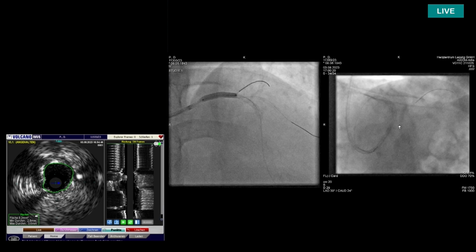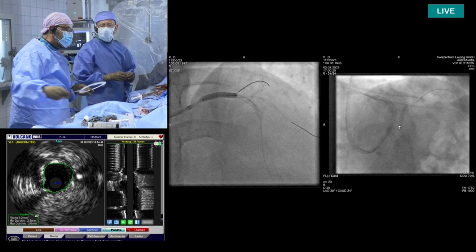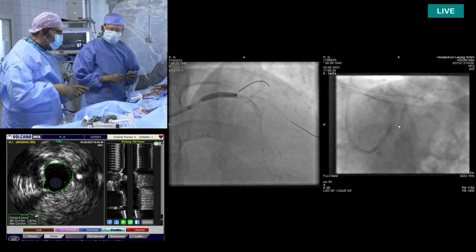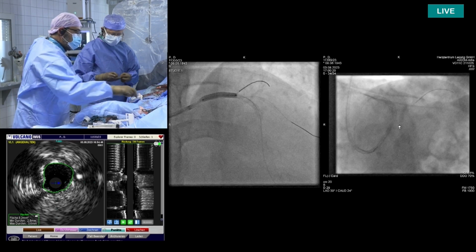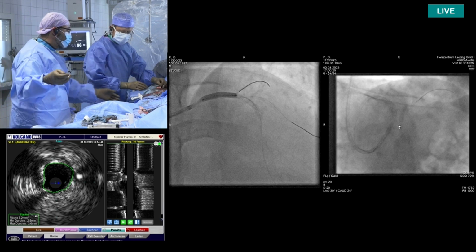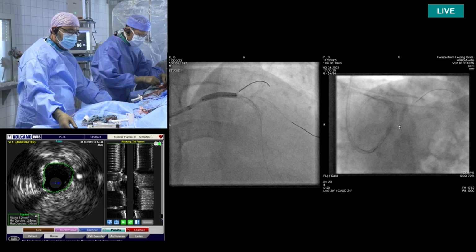So you know that with the development of drug-eluting stents, we used to have stents that had very high radial force. If you remember the Taxus stent and the Cypher stent, if you are as old as I am now. We used to have stents that were stainless steel, with very high radial force and almost no recoil.